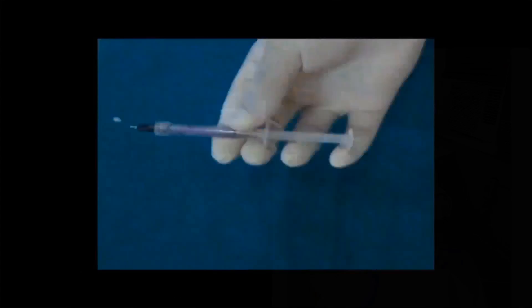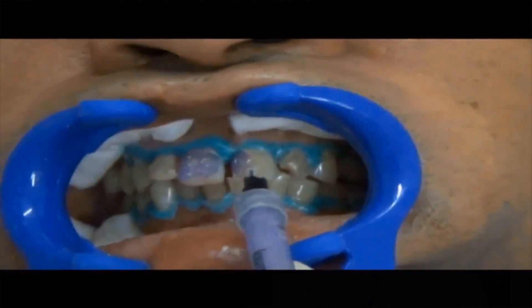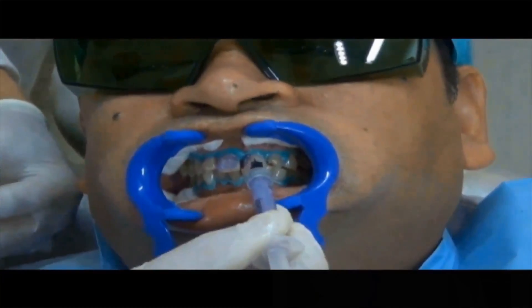Attach the brushed applicator tip on the base syringe. Apply a thin layer of Laser White 20 on the upper and the lower anterior teeth.